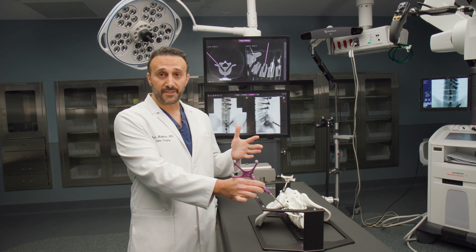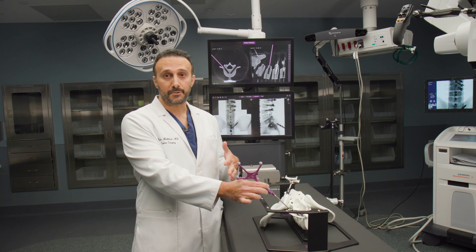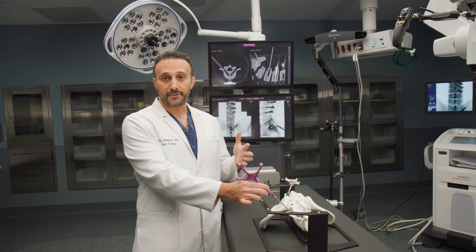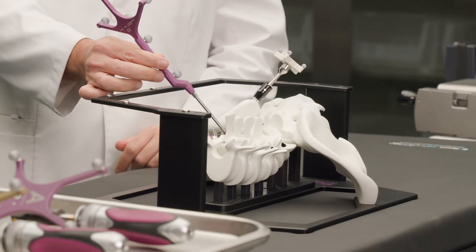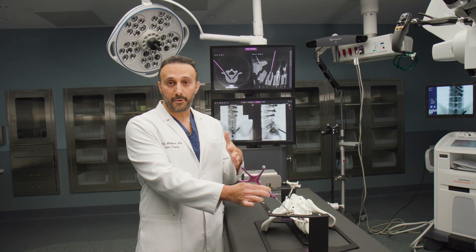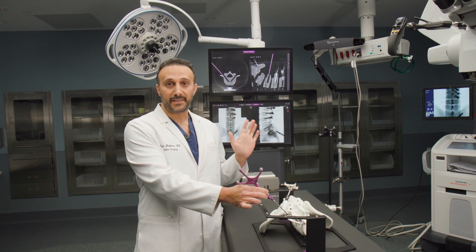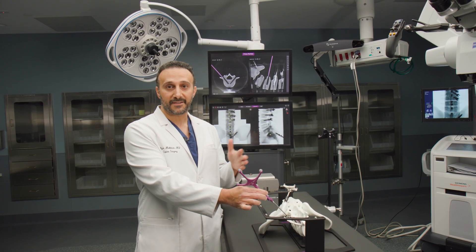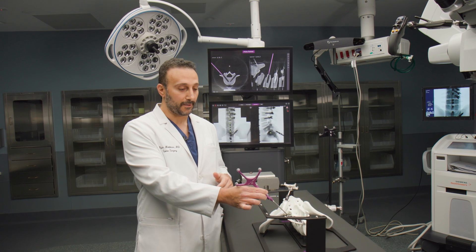Now this setup is for a fusion surgery, but we also can use this in artificial disc replacements, in tumor surgeries, or anything revision where a lot of our normal bony anatomy has been taken away from us and we need this to be able to tell us exactly where in three dimensions we are.